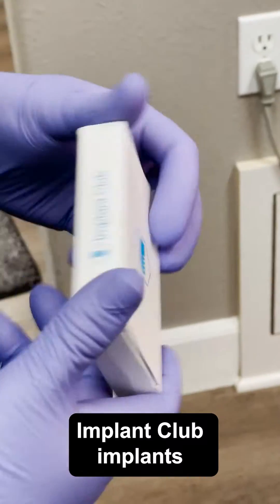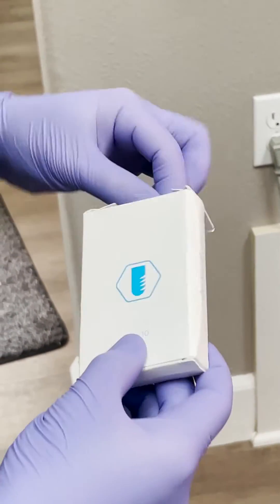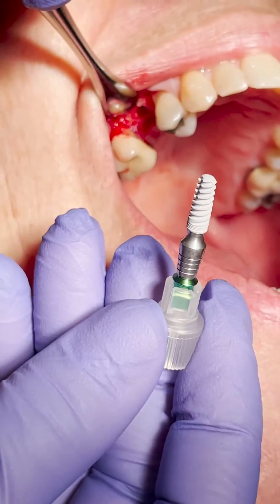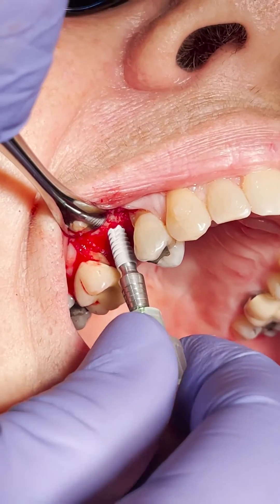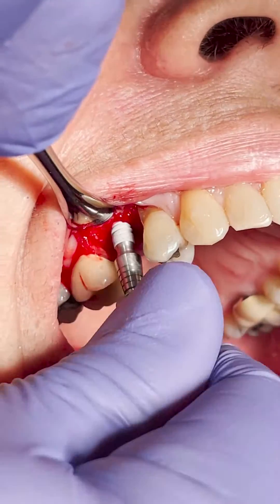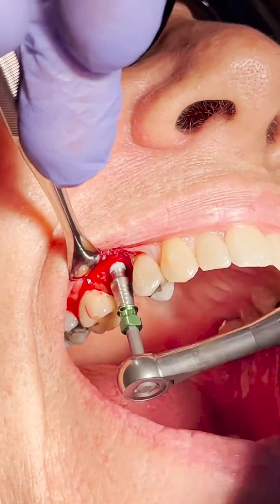I'm using an Implant Club implant for this one — super excited to release our implants. It's making me nervous just watching it on the screen. You put it in with your fingers — it's got this little thumb grip — and you just use that to go all the way down as much as you can. I didn't take it all the way down because it kind of maxes out.